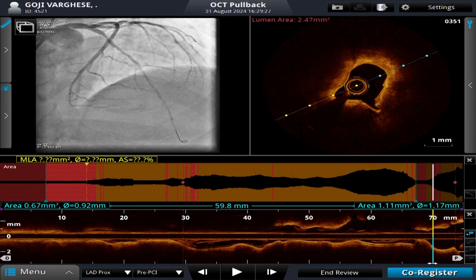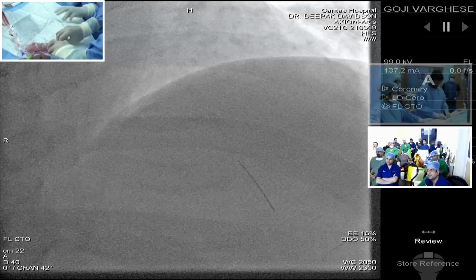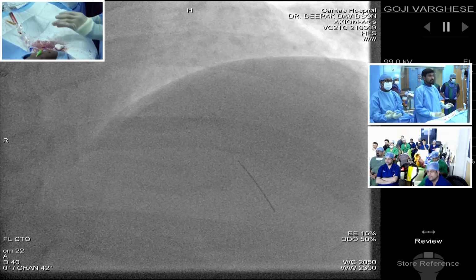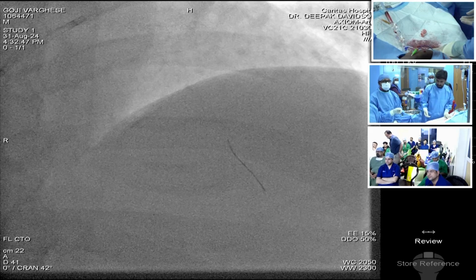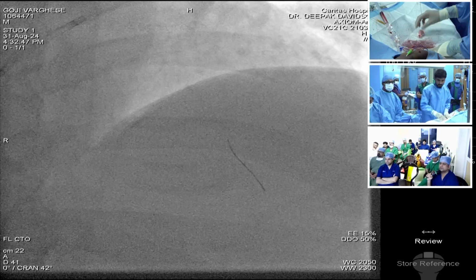So in this case, proximal as well as distal lesion, you have to do orbital atherectomy, or only the proximal lesion? Nah, we felt that proximal certainly we'll have to do. Initially, before looking at these OCT images, I felt that the proximal lesion is not significantly calcified. We would be easily able to manage that. I thought that even the distal lesion, angiographically, was appearing to be more calcified.